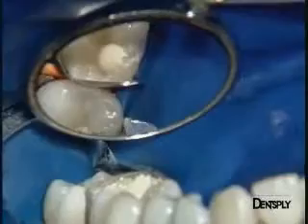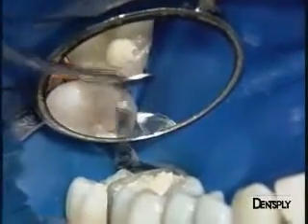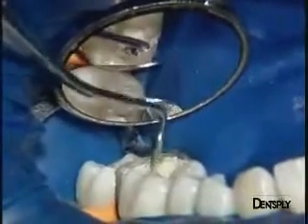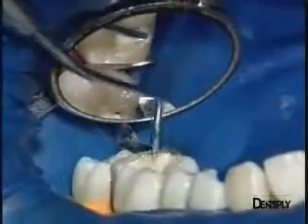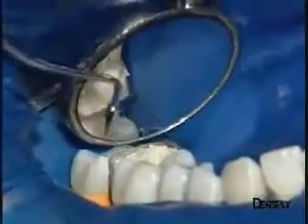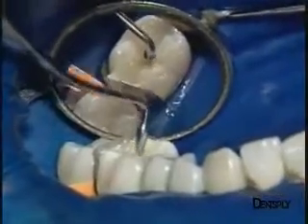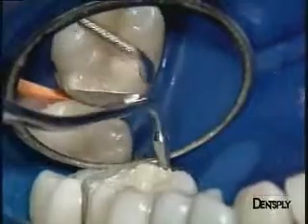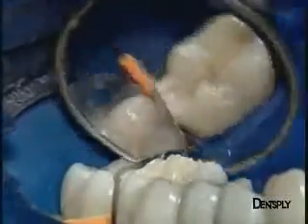We continue to restore the various cusps progressively. Here, see the cusp that has been completely reconstituted. The distolingual cusp should now be complemented by completion of the bulb. It remains to improve the outside contour of the tooth.